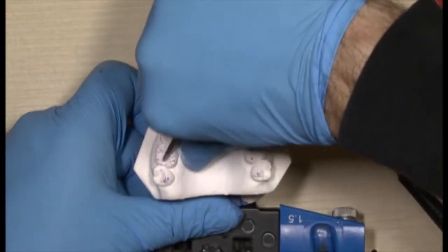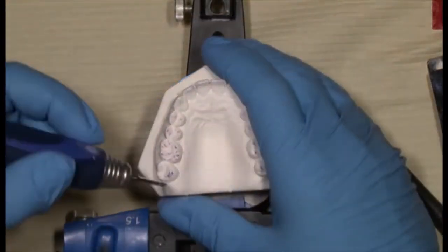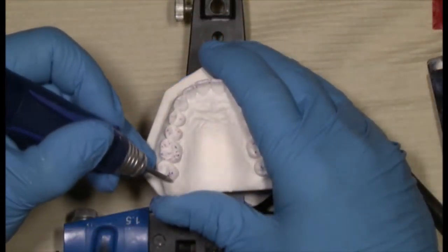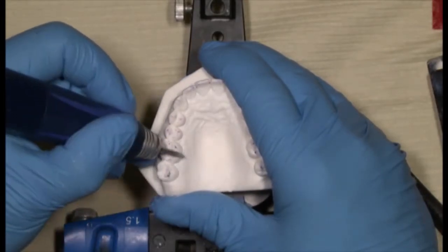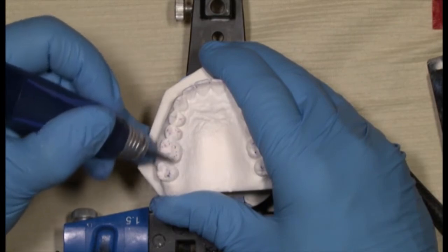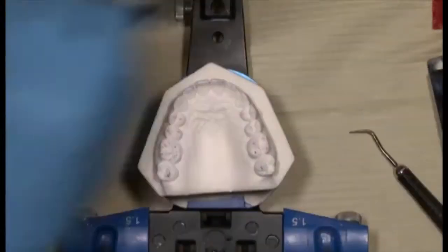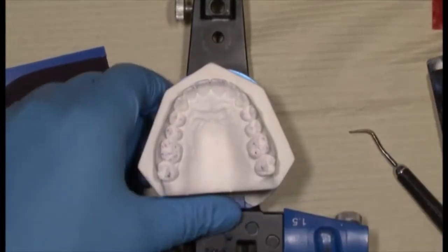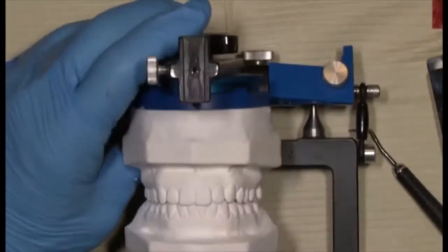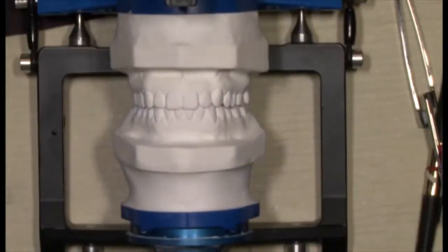Anything central fossa, take it away. These areas of the lingual, take those away. They shouldn't be there. Right? That would make that easier for you. The sooner you get those out of the way, the easier it'll be to make this work. So we're continuing to make progress.